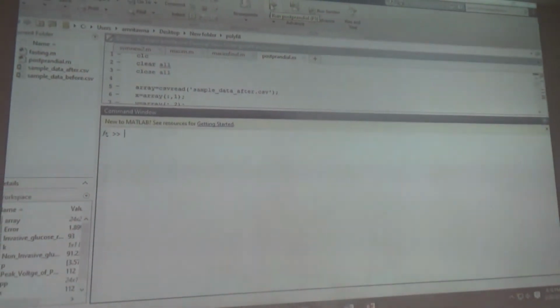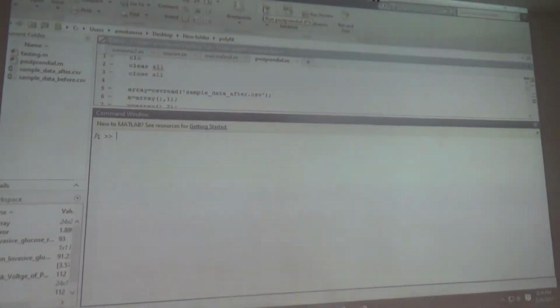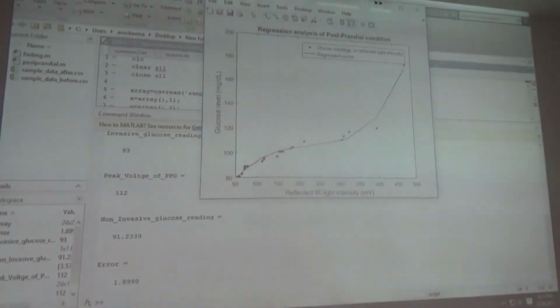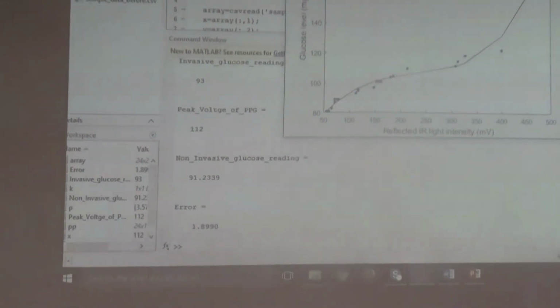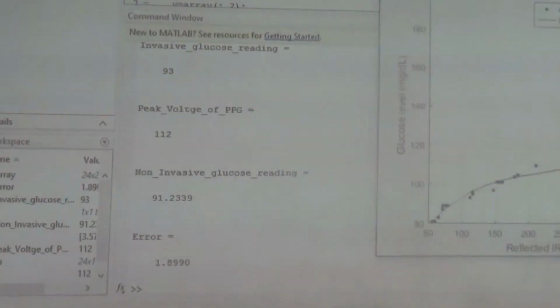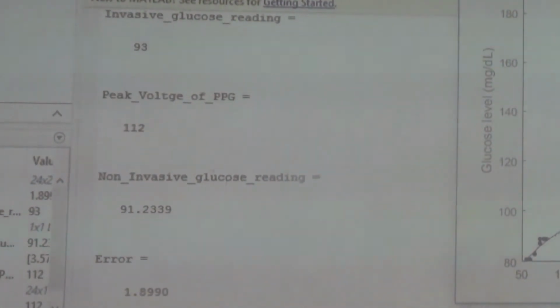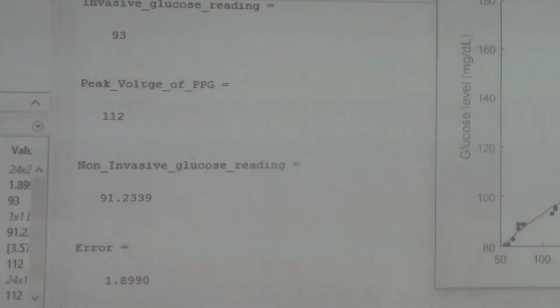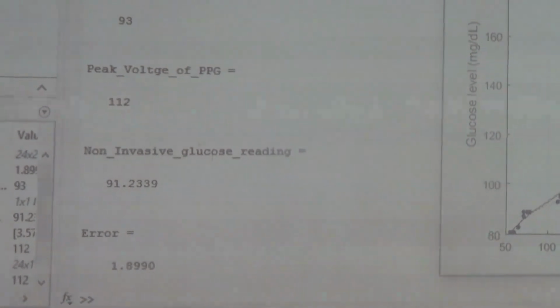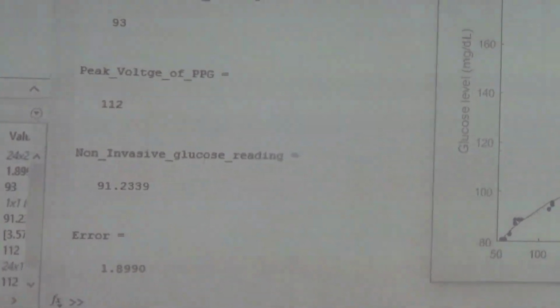Similarly, in case of blood glucose measurement, we are using regression analysis for this purpose. The graph shows a polyfit analysis of postprandial condition from which we can calculate the non-invasive blood glucose level. So here, the non-invasive glucose reading obtained is as displayed with an error of about 1.8 milligram per deciliter.